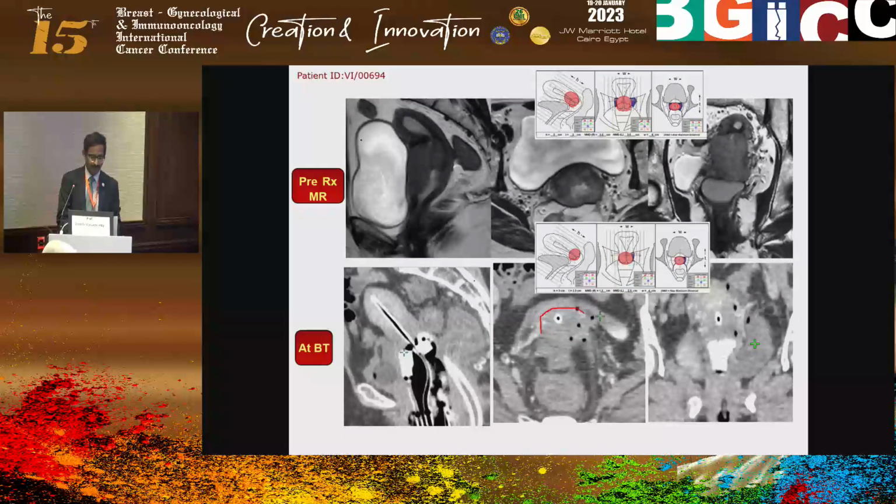From here, I can see something here, I go down. Maybe I'm not very efficient because this pointer is a bit off. So this would be my contour, let's say, as an example. Okay, so let's say you draw this, go back and measure what is the NMD from this side to this side, this side to this side. If it is matching to what clinically you have done, then you are perfectly all right.